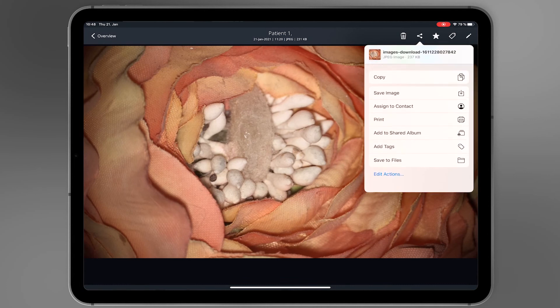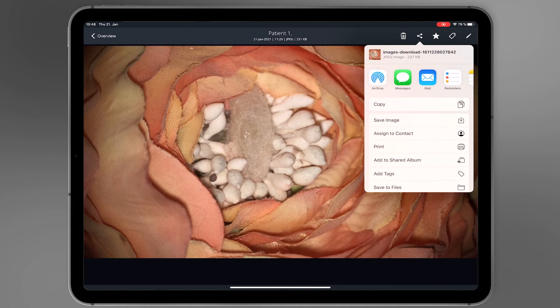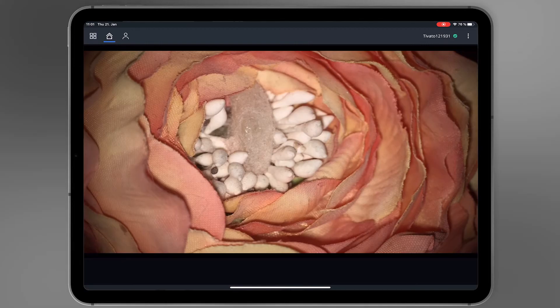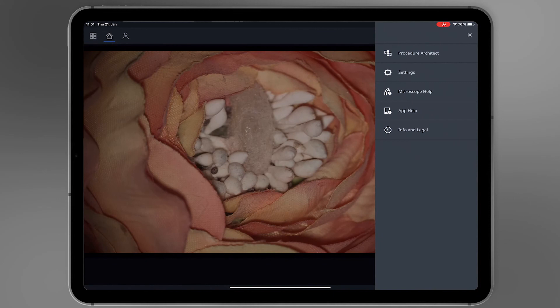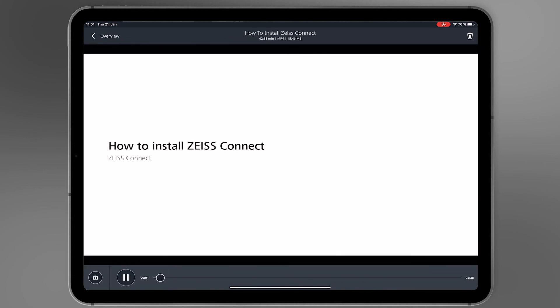For example, saving to camera roll or sharing via email. In case of questions, select the Help section of the GUI. Further information can also be found in the Instruction for Use manuals and in several how-to videos.